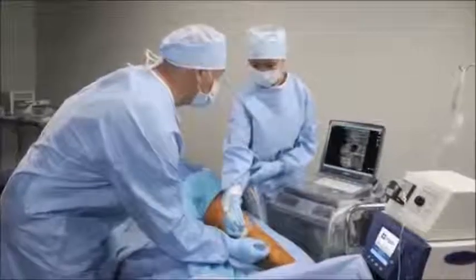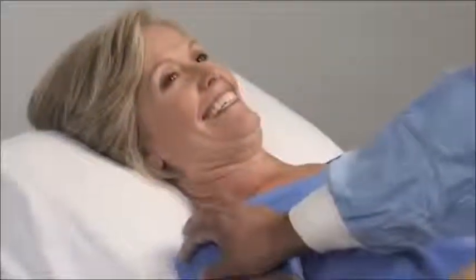The benefit procedure provides doctors with a controlled and repeatable treatment experience.